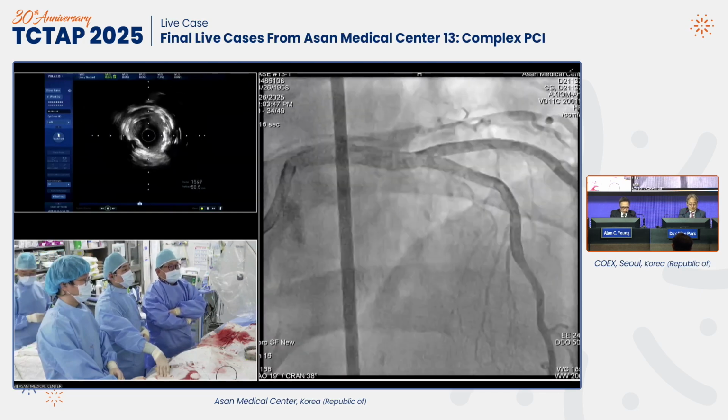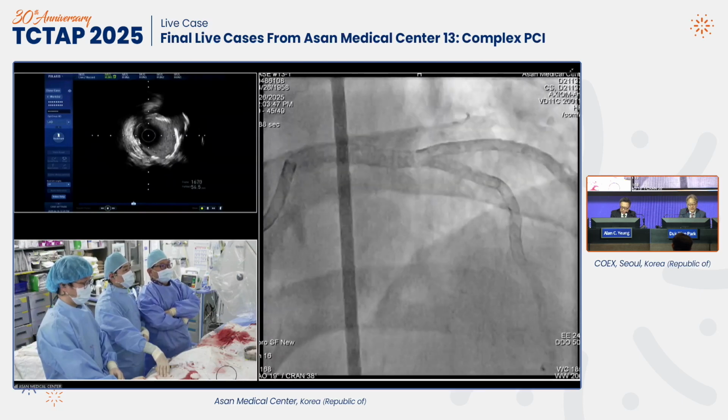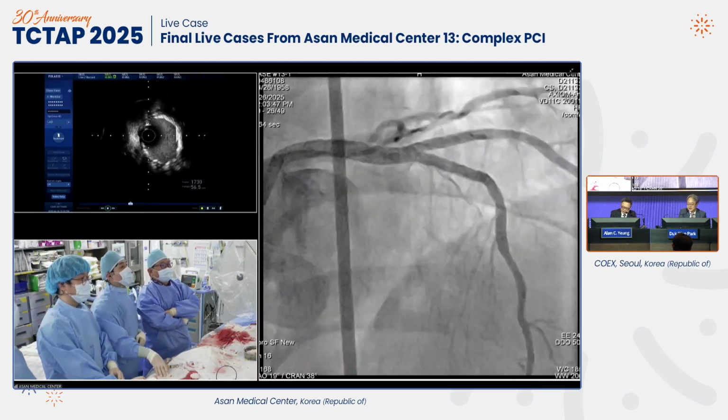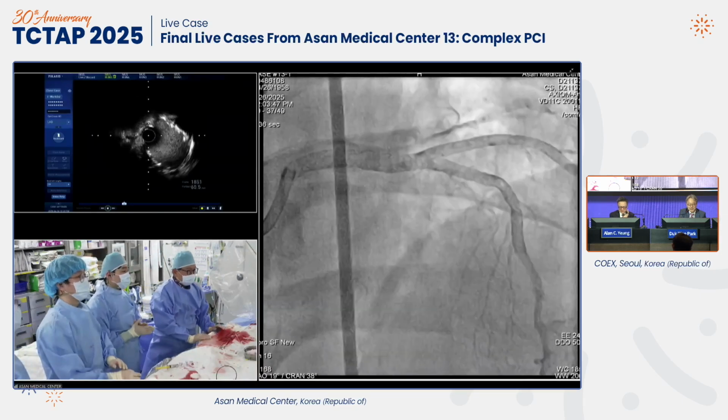Thank you very much. Excellent job, Jung-Min. A very complicated, really ugly-looking case, and now it looks beautiful. Thank you. Okay, we move on. Great, you did a good job.